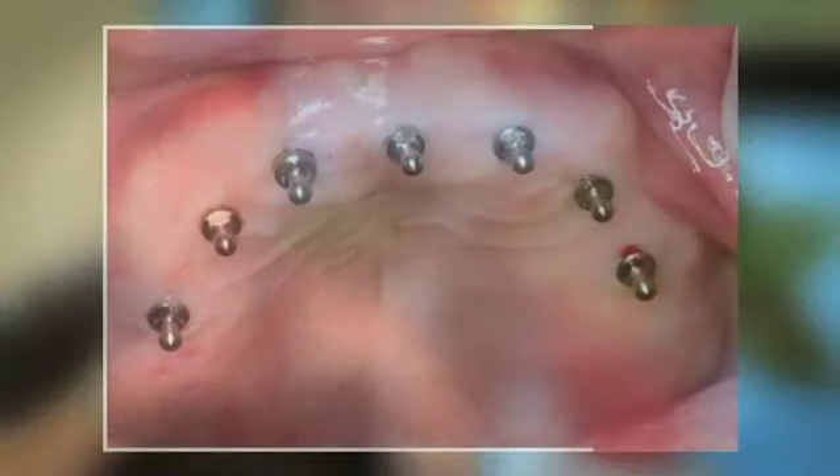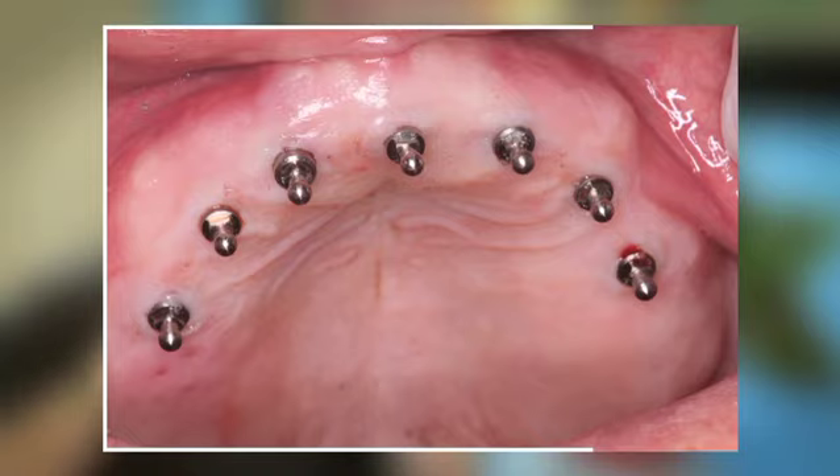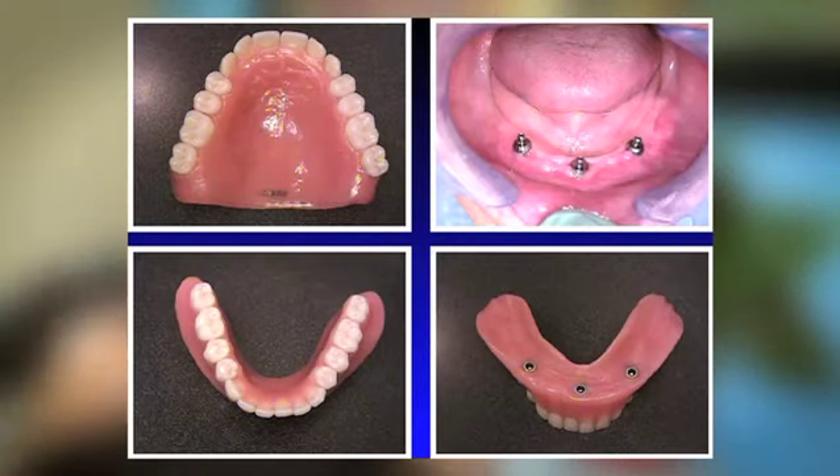Originally these were supported by remnants of teeth — teeth would be left and we'd put attachments into them to make the overdenture stay in. But with the advent of implants, we have a much better way of doing this. What I would recommend now is having some implants placed, then adding an attachment onto the implant and an attachment into the denture. The denture just snaps down and locks onto those attachments, giving the patient a fixed type of appliance that they can eat on — it's not going to come bouncing out of their mouth.